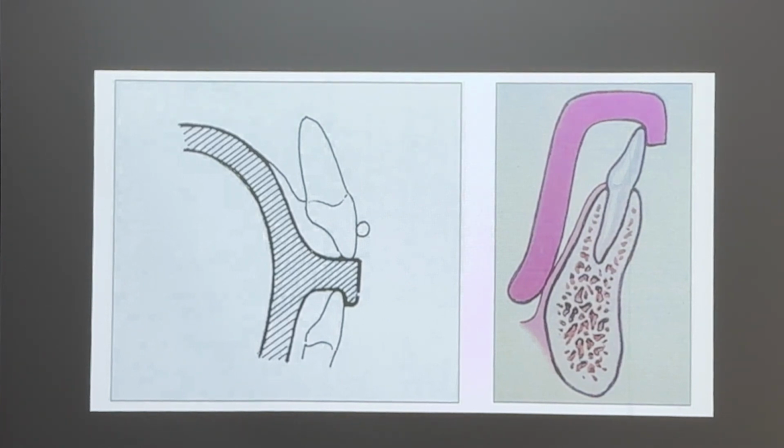But if you use more well mixed resin from the beginning, it will make another problem. If you bite the appliance, a thin film of resin will be there. So the appliance height changes. So I don't recommend it. Please don't make the appliance height change.